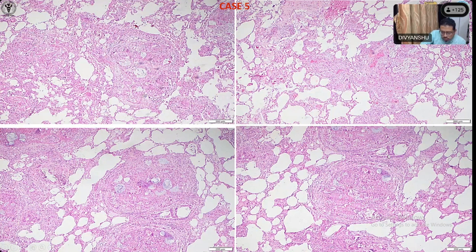Columnar epithelium. Yes, a columnar epithelium. So this is the bronchus. Yes, and where are the granulomas located? On either side of the bronchus, it is causing compression on the bronchus. Yes. Okay. So is there any peripheral demarcation in these granulomas? Yes, sir. There is fibrosis.